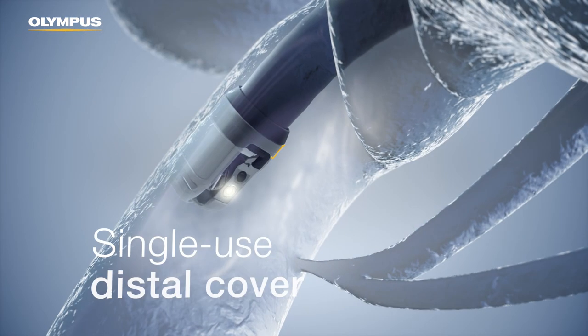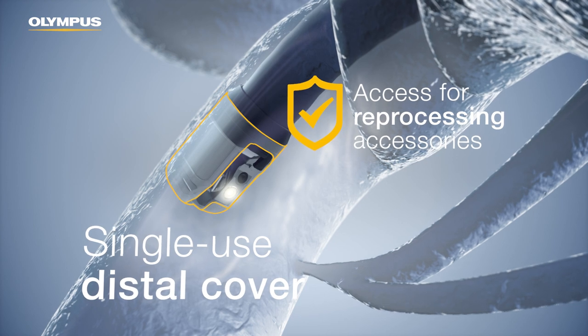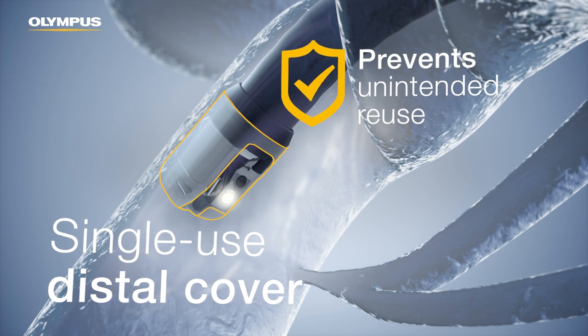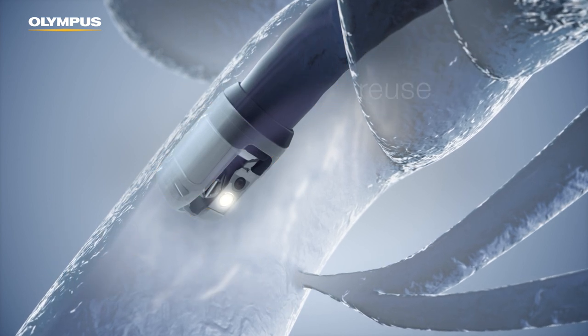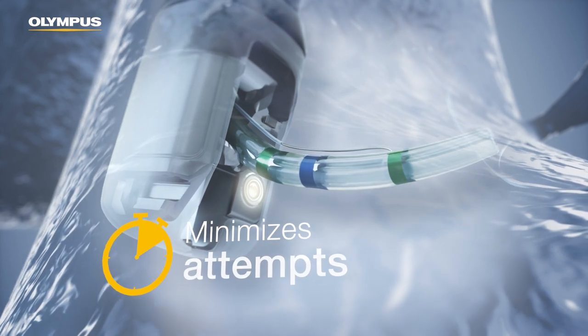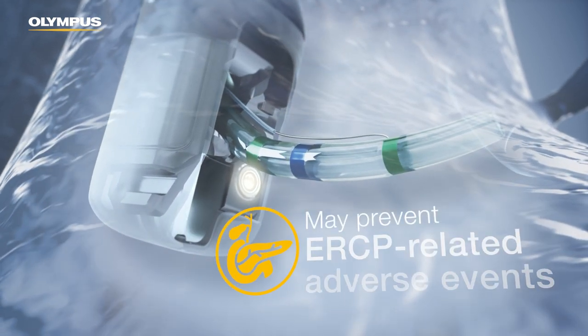Its single-use distal cover allows access for reprocessing accessories during manual cleaning and is destroyed during removal to prevent unintended reuse. Minimizing the amount of cannulation time as well as the number of attempts and injections is essential.